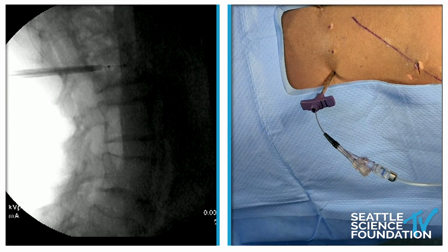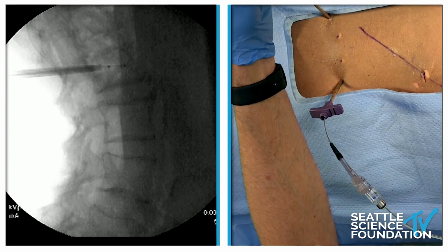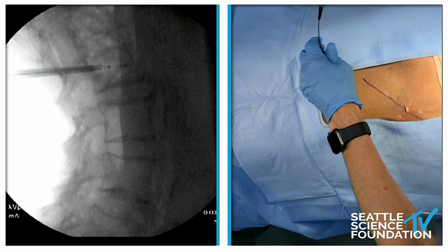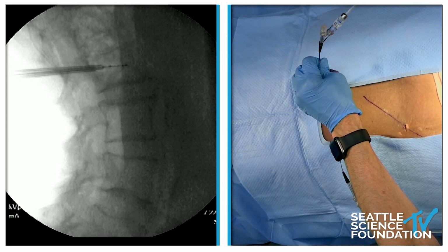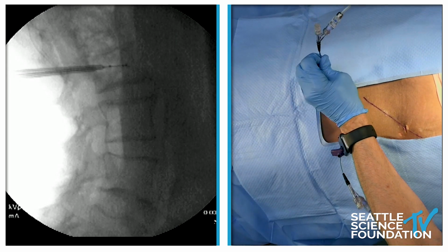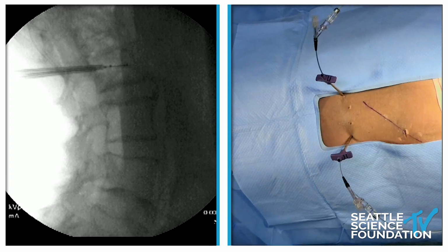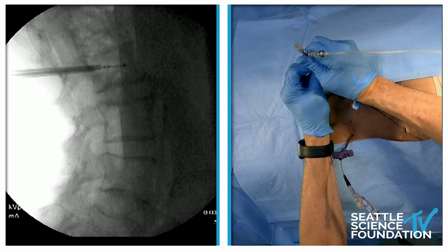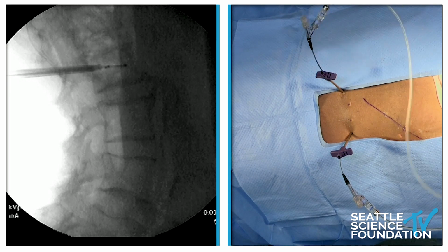And remember, lidocaine is something that we use and inject intravenously all the time for cardiac arrhythmias. So just make sure you don't inject too much. More than 17 cc's of 2% lidocaine is about as much as you want, to avoid lidocaine toxicity. Lidocaine toxicity is characterized by numbness, and you'll have a little bit of confusion, followed by delirium, followed by worse. And so we're lined up pretty well here, and I'm going to inflate one of the balloons.